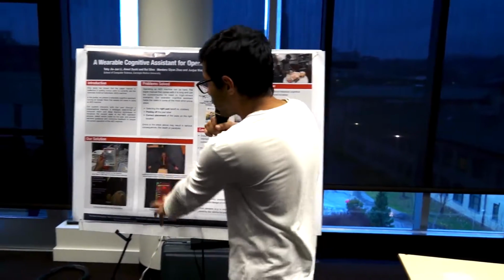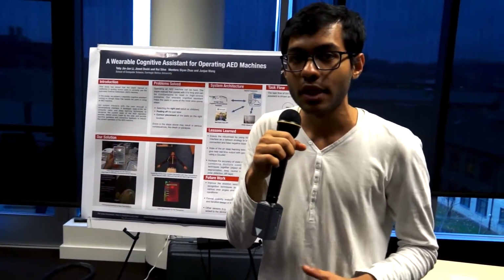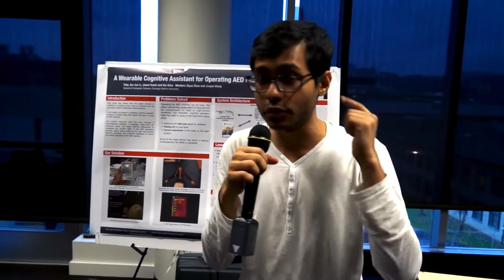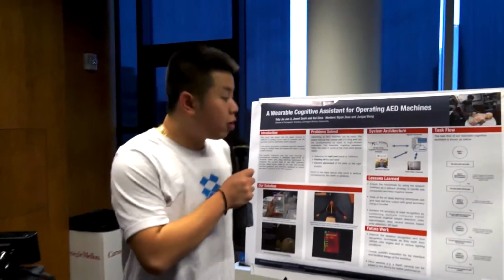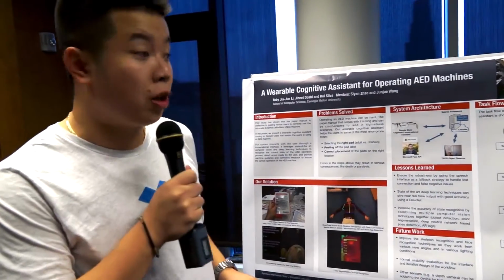And all across this, we are using a voice-based system so that the user knows what is to be done. He's constantly instructed using the voice medium, so he knows what is to be done. Even feedback is given to him, corrective feedback. And I will talk about the lessons we learned through this process and our future work.